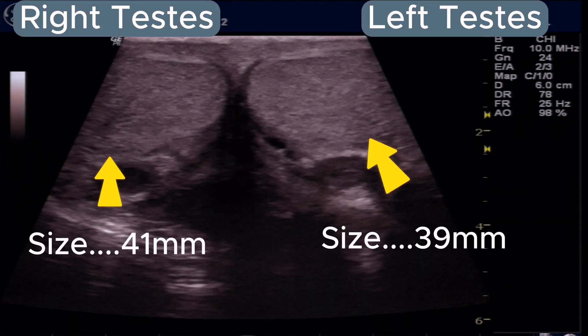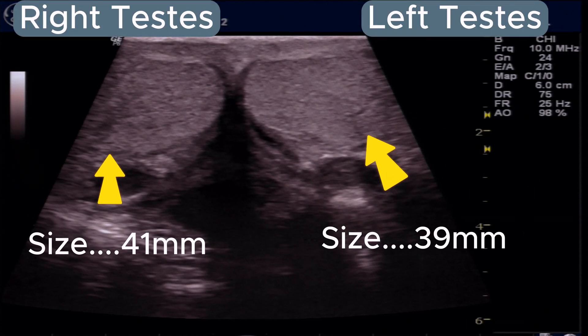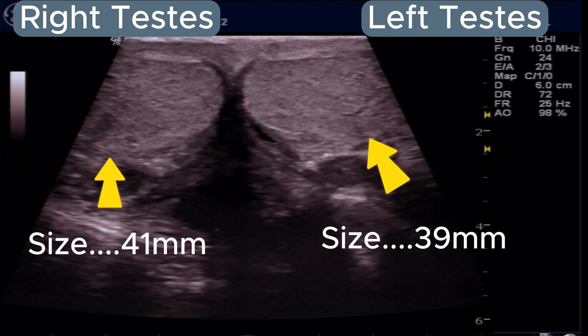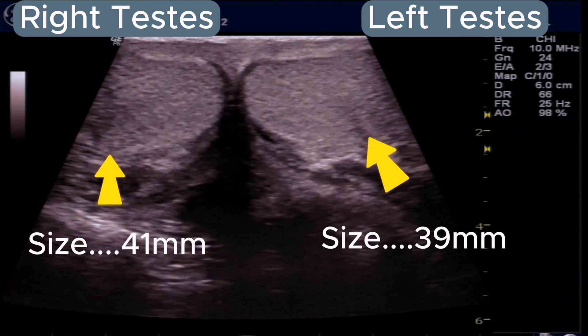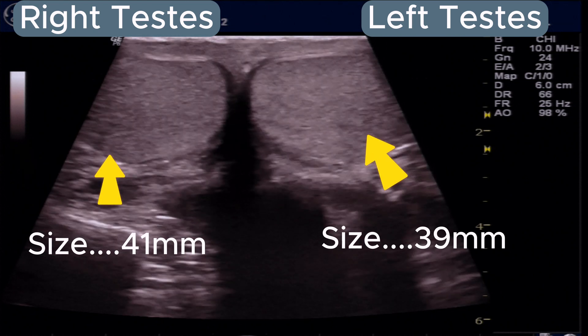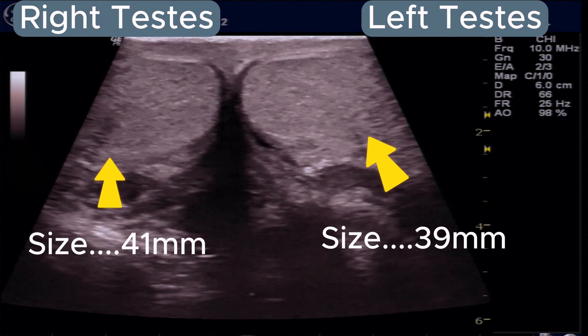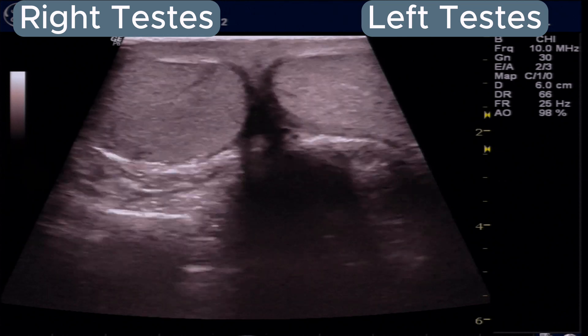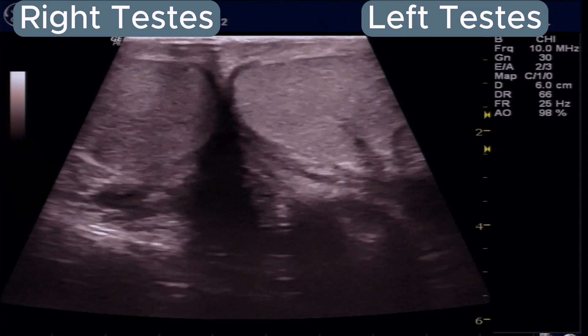In the transverse view we can see both testes. These are normal in size and echotexture. No mass or cyst is seen in the testes.